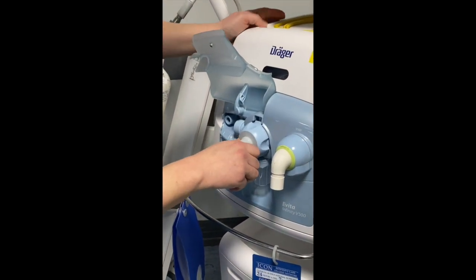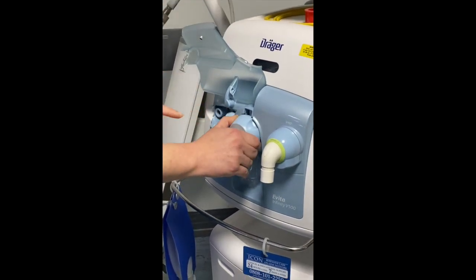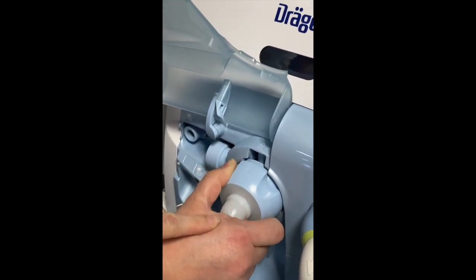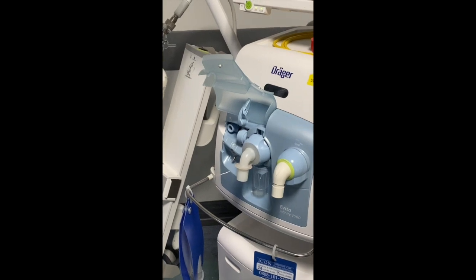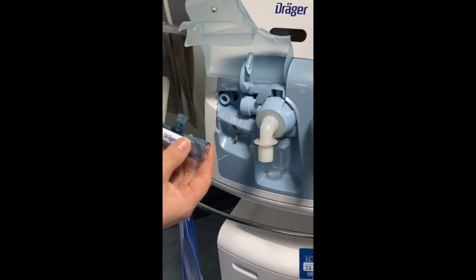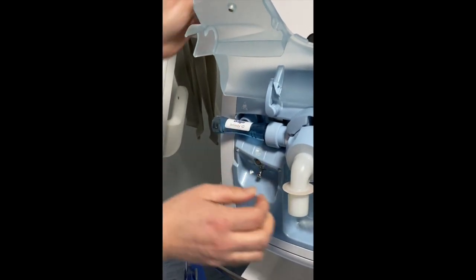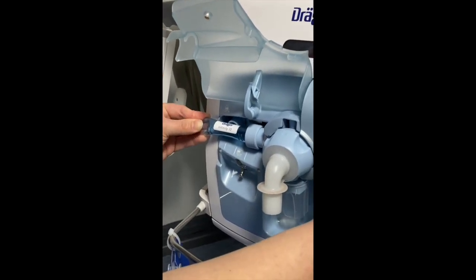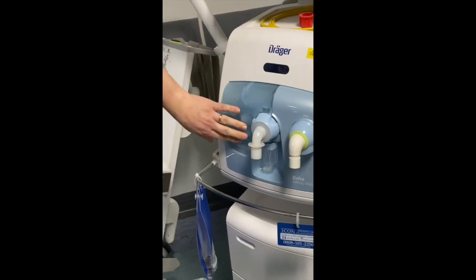You push it in and then you twist — there's an arrow on the top, you twist it to the right where the arrow points to the locked part. Next, you need your expiratory flow sensor: push it into here, then push it towards the right and it fits into the expiratory flow valve. Pop that down.